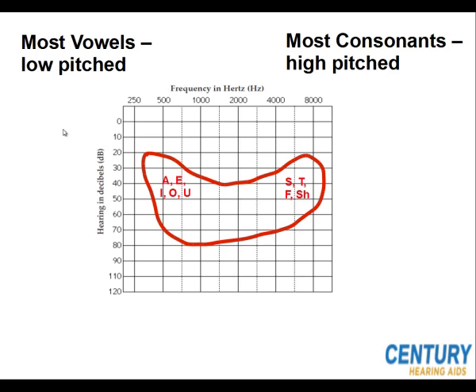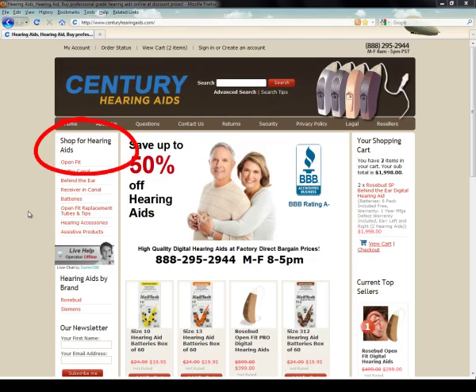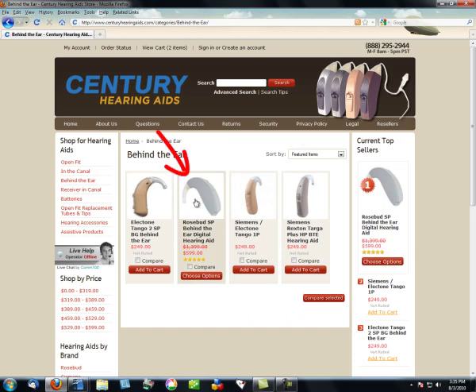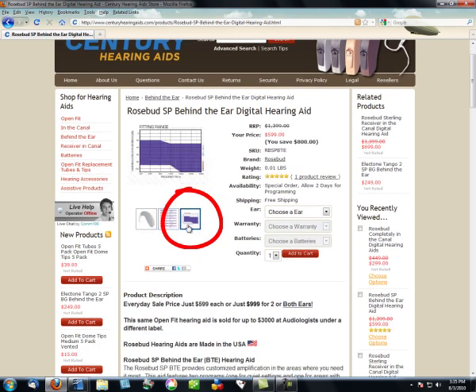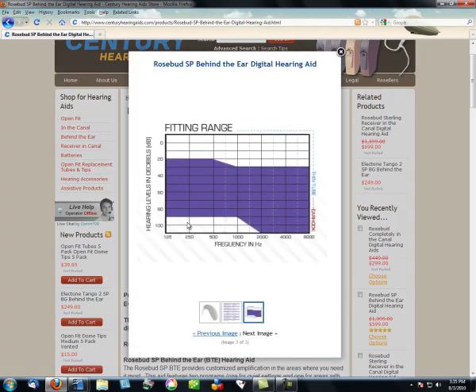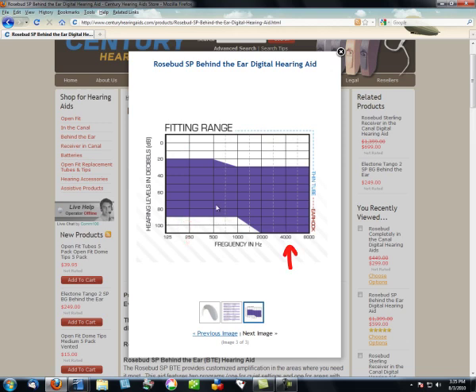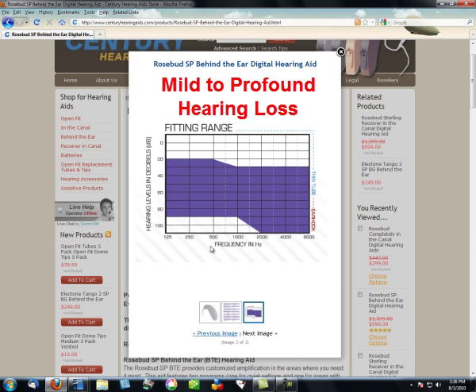Let's tie all this in so you can read your audiogram and choose a hearing aid that's best fitted for you. All hearing aids come with a suggested fit graph. Now that you're at Century Hearing Aids, let's go to Shop for Hearing Aids and click on Behind the Ear Hearing Aids. Find the Rosebud SP Behind the Ear Digital Hearing Aids and click on that to open the product. Double click on the graph — this is the fitting range for this instrument or hearing aid. As you can see, it runs from 20 down to about 30 in the high levels, and from 90 to 120 in the lower levels. This product is developed for individuals with mild to profound hearing loss.